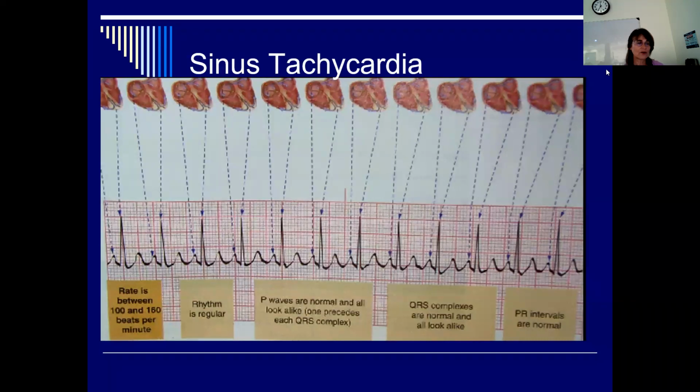Okay, so here is the, I don't know, is that a 6-second strip? Yes, it is. So what's the heart rate? Very good. Is it a regular rhythm? Are there P waves? One before each QRS?